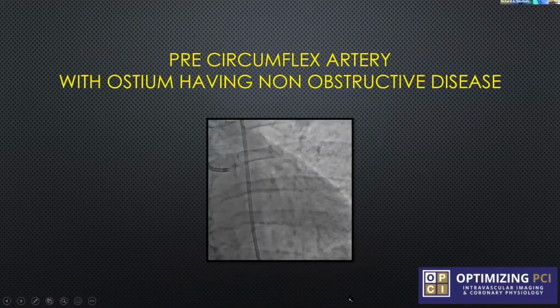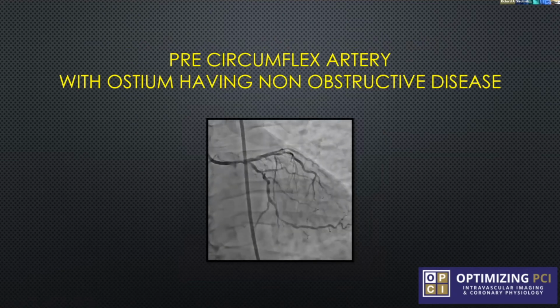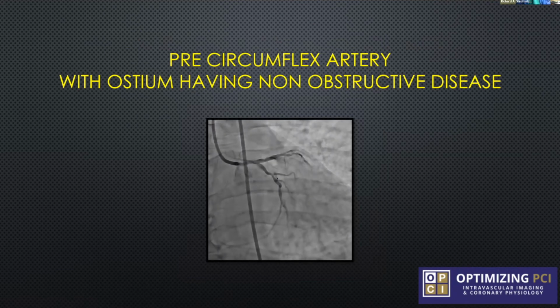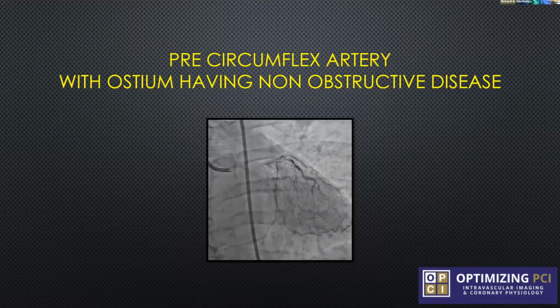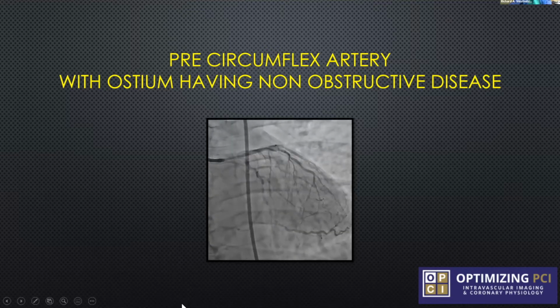When I got to the left system, it looked a little different than their angiogram. I went in with a 7 French guiding catheter because I thought I might have to do a bifurcation. The left main looked good on their pictures, and there was no indication it was left main disease. You see that there's mid-circumflex disease and distal circumflex disease, and the LAD, not in this view, you can't tell, has disease as well. The proximal part of the circ looked like it was preserved. And I had damping with the catheter, so I was concerned I had left main disease. So what I was hoping to do was treat the circumflex and hope that the ostium of the circumflex was okay, and then I was going to assess the left main and the LAD. So that's what we did.